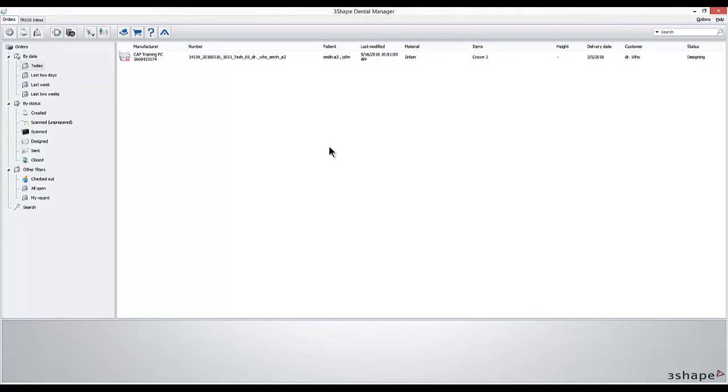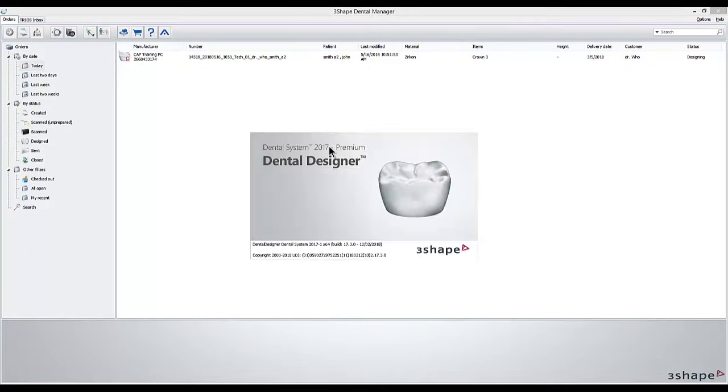Welcome to Capacademy. In this video we're going to go over a single full contour crown design.